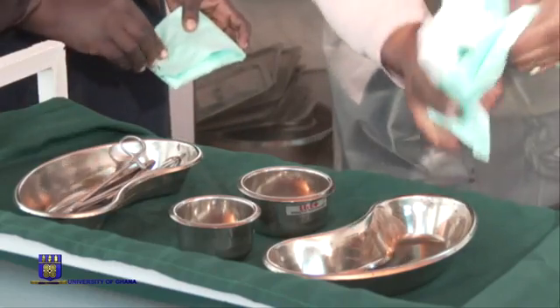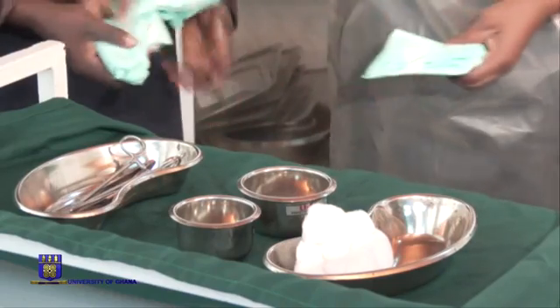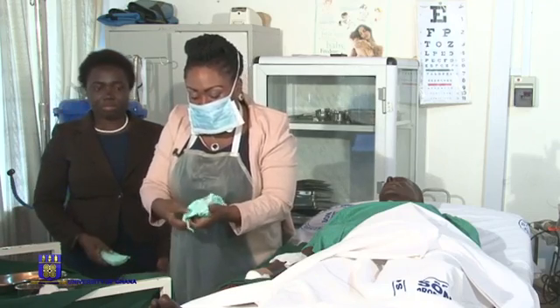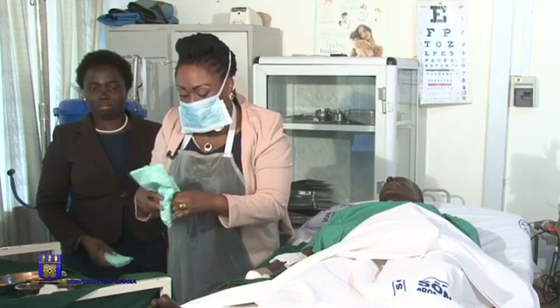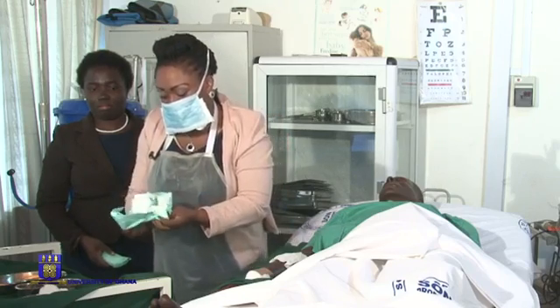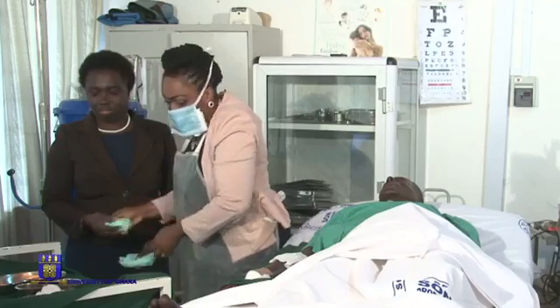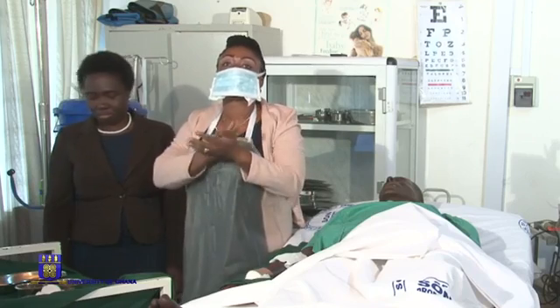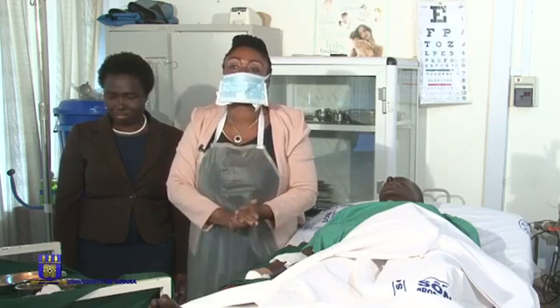Please know how to drop your swabs without contaminating the sterile portion of the trolley. So we have our cotton wool swabs for the cleaning and our gauze swab. You look at the size of your wound so you don't contaminate the swabs. The assistant now comes in to pour the lotion whilst I wash my hands for the last time because I'm about to start with the procedure.